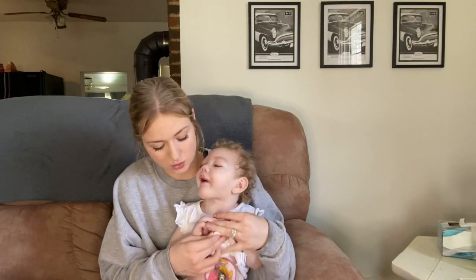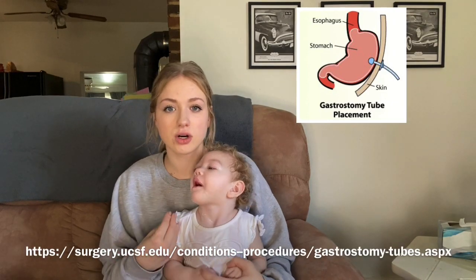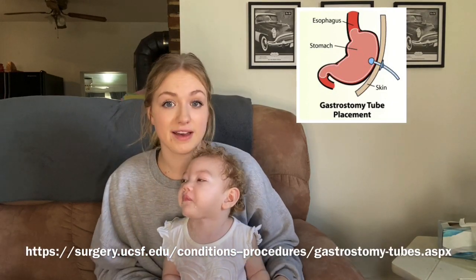One of the questions is: what is a G-tube? A G-tube is a little passageway — here's Kendall's — it's like a little button that goes into your tummy, and that's how you get fed. Maybe all your meals, or maybe just some of your meals; it depends.